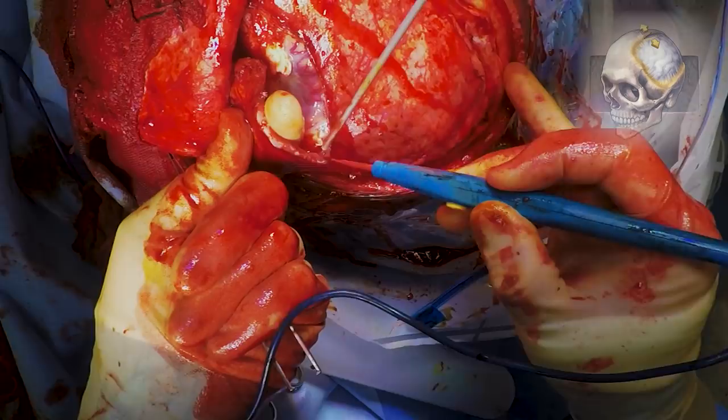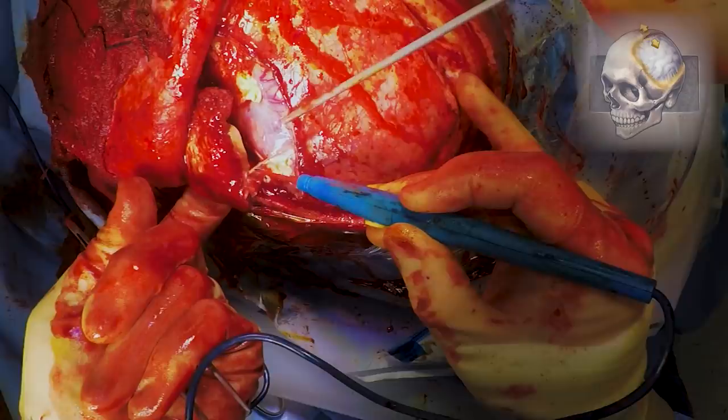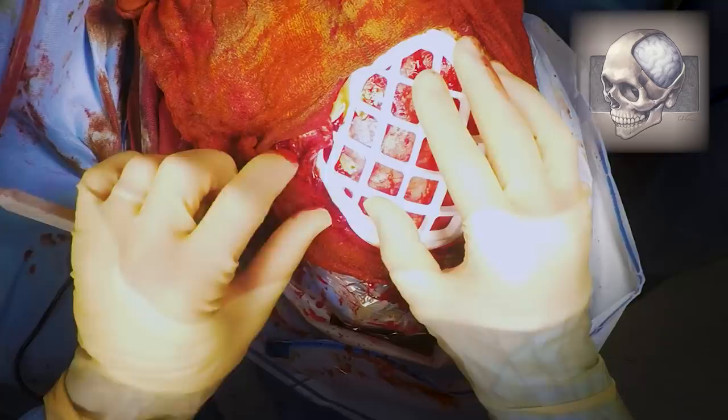We're going to carefully cut this away so that we can stitch this over the top of the cranioplasty plate, and that will help give a good cosmetic result. If you don't do this the temporalis muscle can fall back down towards the cheek and create a lump in the side of the face. Now we've revealed the bone edges and the scar tissue has been removed. We can start to make sure that all of the bone edges are nice and clear for the plate to sit. These swabs are soaked in betadine, which is an antiseptic solution and will help to keep everything nice and clean. This is a fitting template and this will tell us that everything is flush and ready to go before we take the cranioplasty plate out of its packaging.